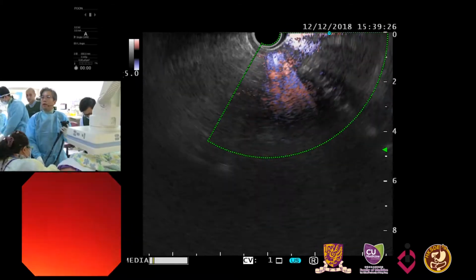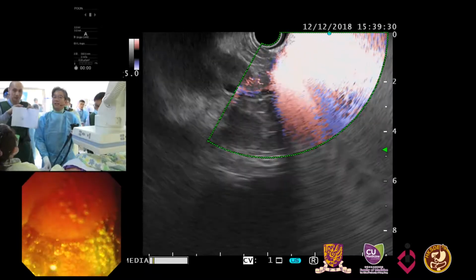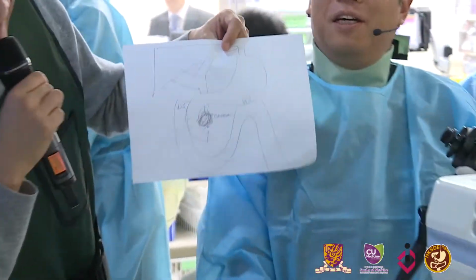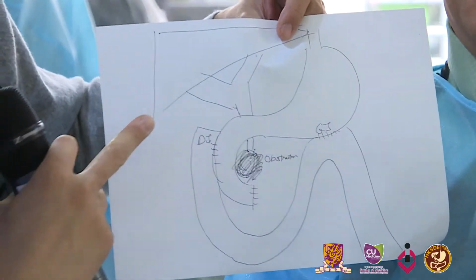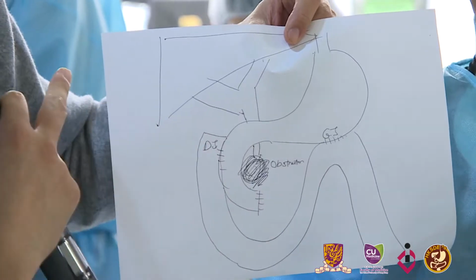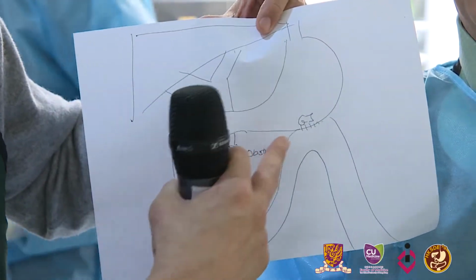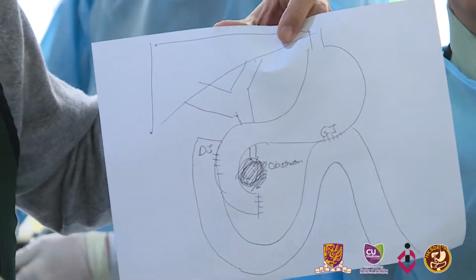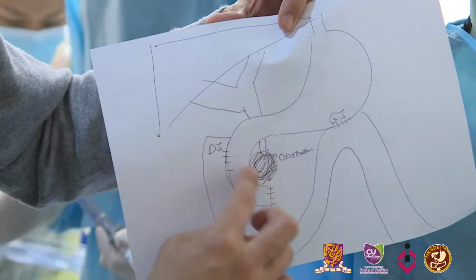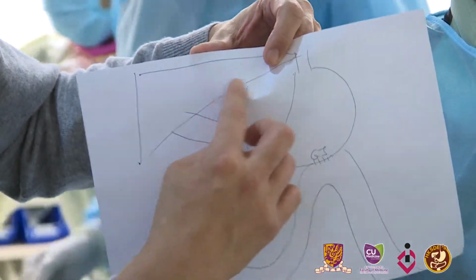Actually, I've drawn the anatomy for you. I was hoping you would. Can we zoom in? Can you see it? Zoom in on that picture. It's very helpful. So this patient had a duodenal resection here. So he had an anastomosis, DJ, but this didn't work, so we had to do a GJ here, so all the food is going this way, but now he has a recurrent biliary obstruction here. So we're going to try to drain either through the duodenum or through the HGS.